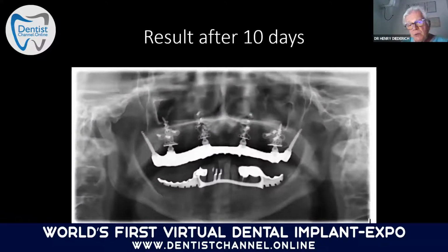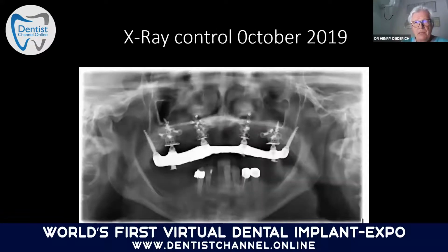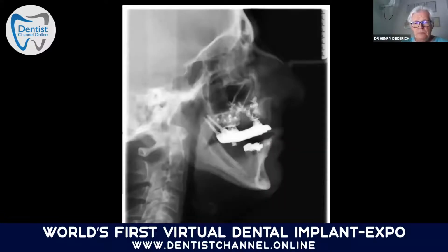So the protocol here was pterygoid implants and 4 plates because there was no more bone. And it was done in a minimally invasive procedure. And here it was some years later, in October 2019. And also here the patient was fine, no problem all over the years. And here, teleradiography, you see how it is done.